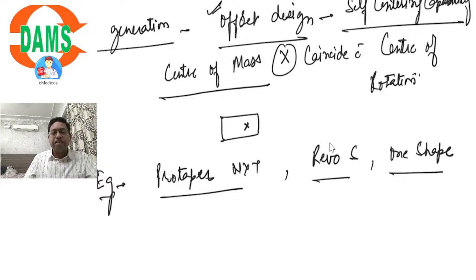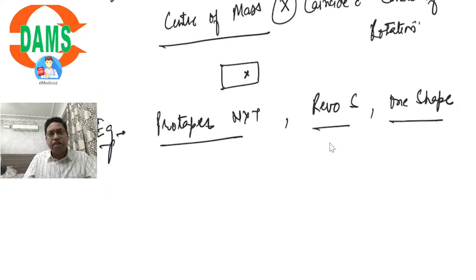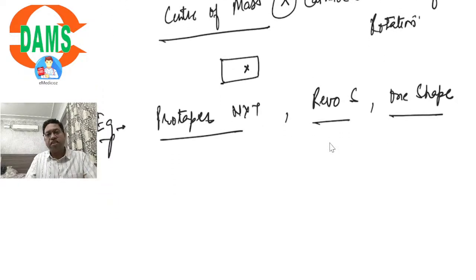Okay. These are the generations of your nickel titanium instruments depending upon their design characteristics. So prominent ones are the rotary definitely, but there are certain alternate motions also for these instruments.